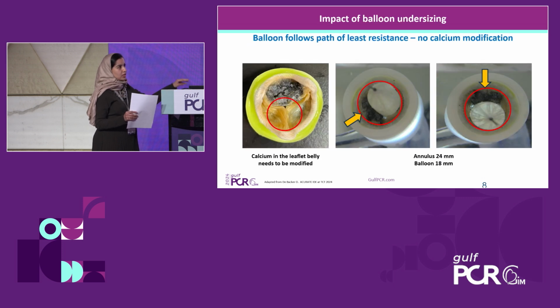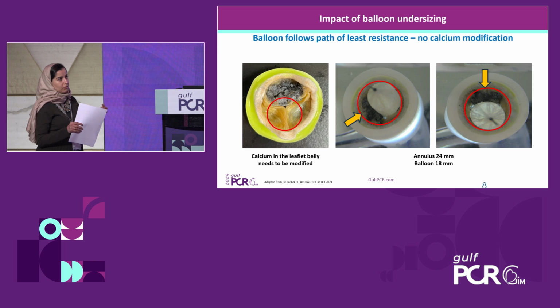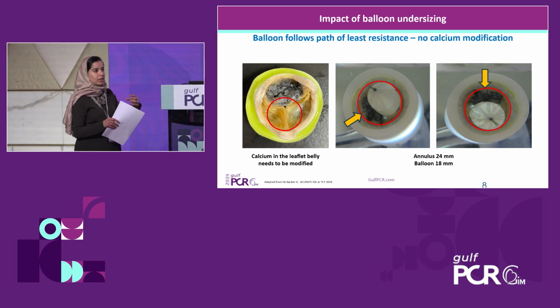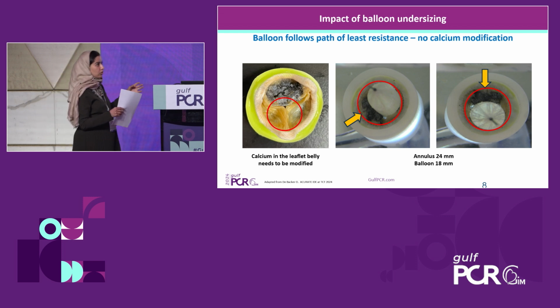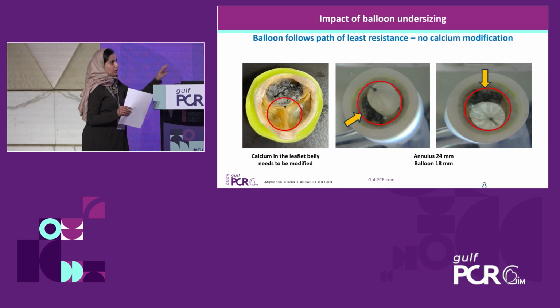I think we have other images here to show that. The balloon is going to follow obviously the path of least resistance. So if you use it and it's undersized, it's still going to expand, but it won't really give you the effective pre-dilation that you want before the valve implantation. I think we can stop here.